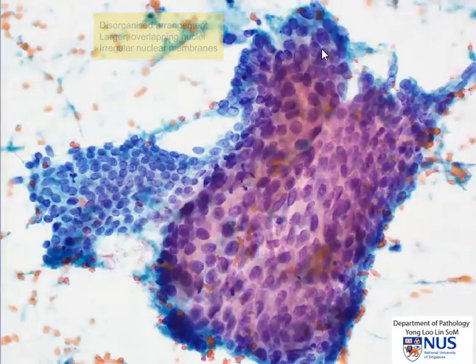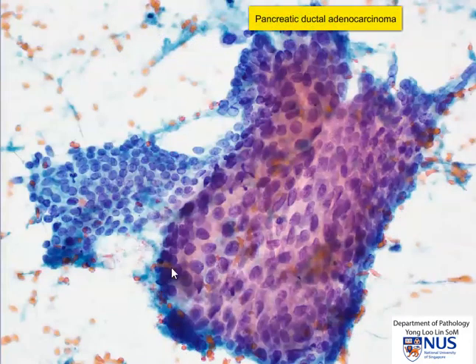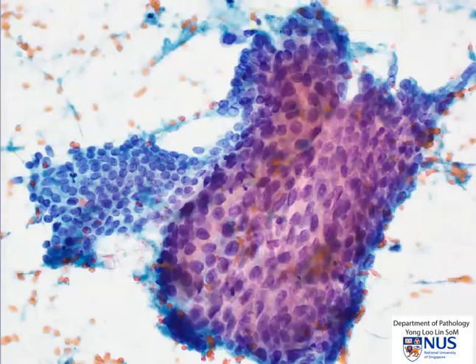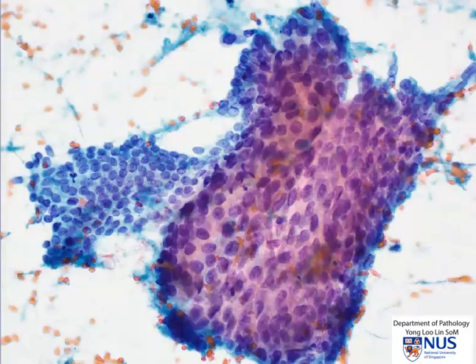So this is actually an example of pancreatic ductal adenocarcinoma, contrasting this with normal GI contaminant epithelium. Benign pancreatic ductal epithelial cells can also look similar to this, and often the sheets of cells are smaller than those of contaminant gastric or duodenal epithelium.